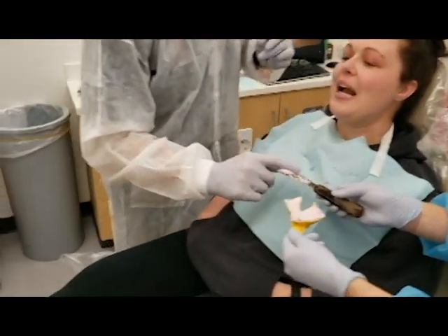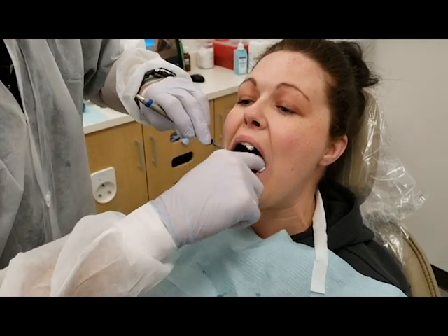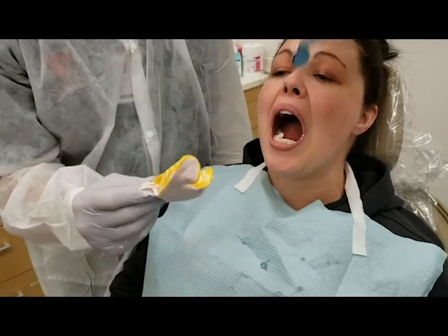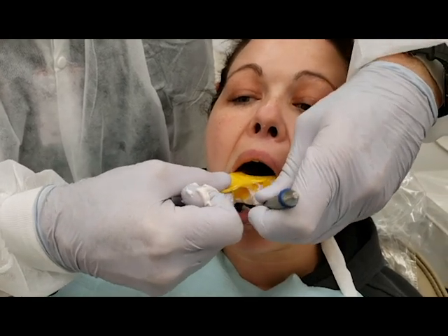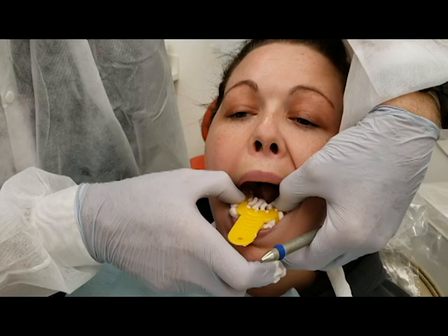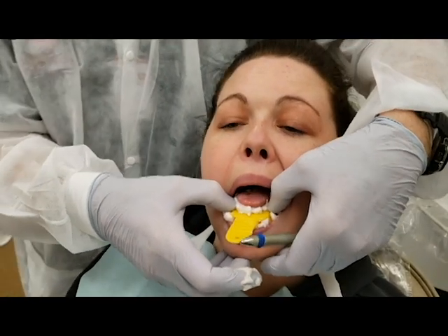On a lower, we do the same thing — we'll wipe this excess into those important occlusal surfaces. Same idea: the mirror retracts on the left, the tray is rotated into place, the mirror is brought to the anterior. Tongue up and tongue out — very good — and then just relax. We'll let that set.